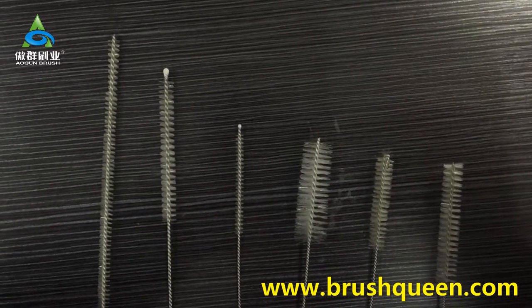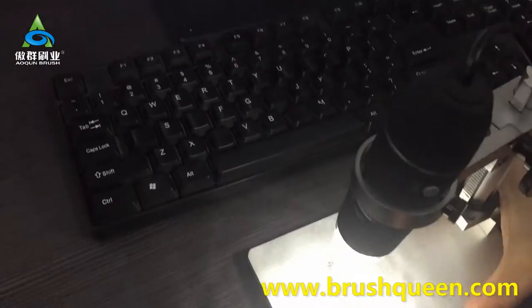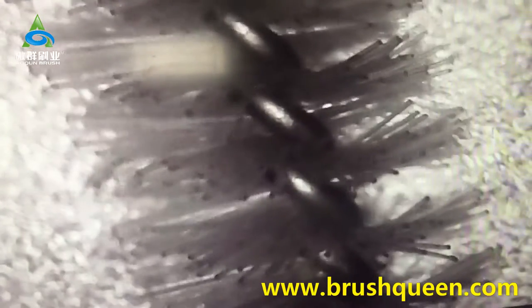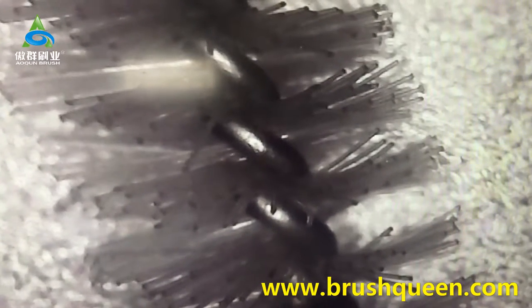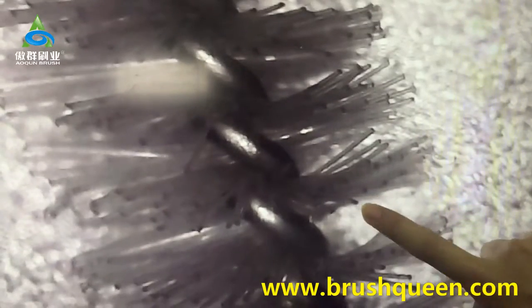We can use the microscope to see whether the filament has burned. The brush is put under the microscope and enlarged to many times. If you see some minor things at the end of the filament, that is a burr. You can see the burr.